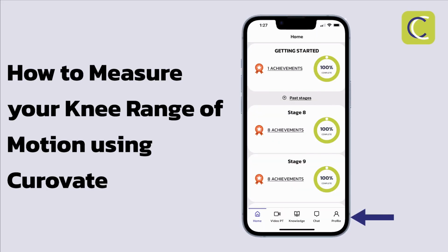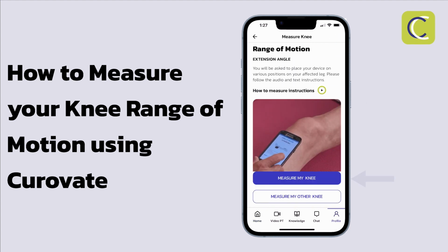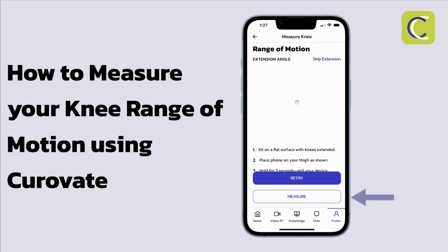From the home screen, select Profile, then select Measure Knee. This will allow you to measure your knee straightening and your knee bending.